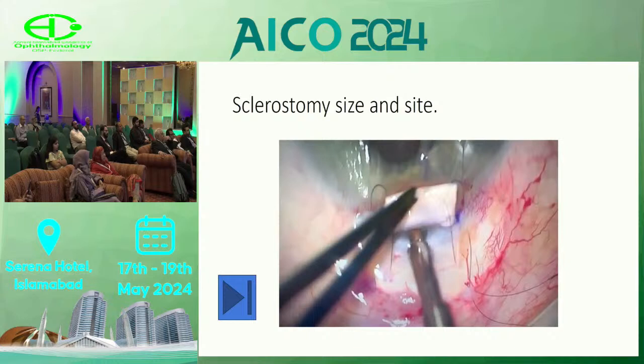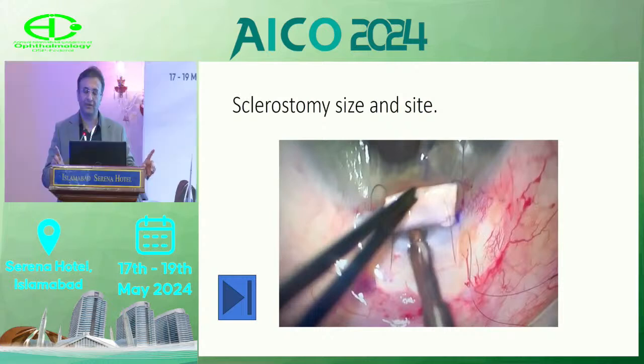Assalamu alaikum. This instructional course is designed to teach releasable sutures and suture lysis.